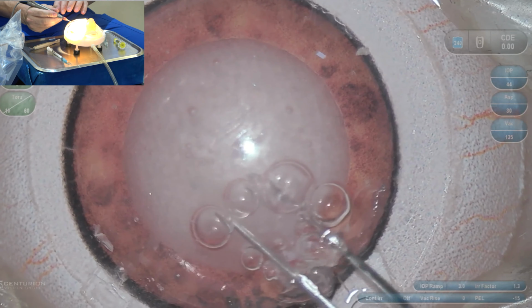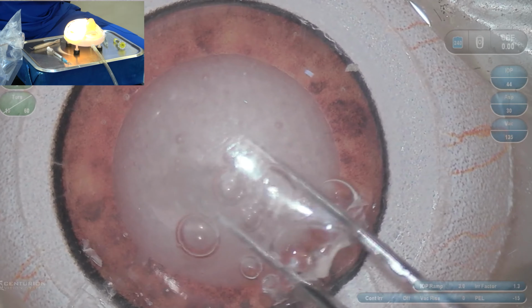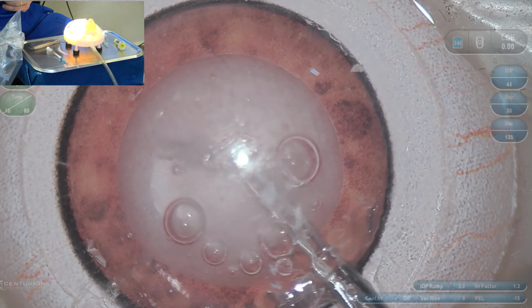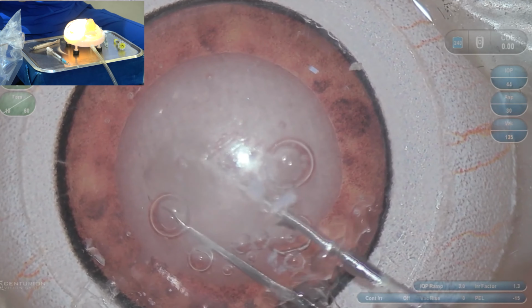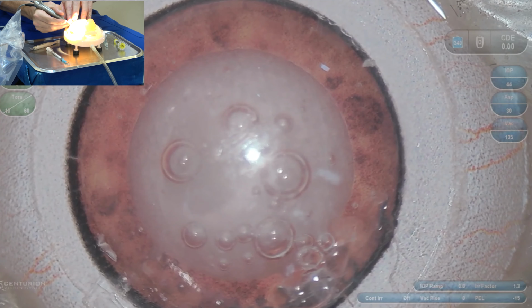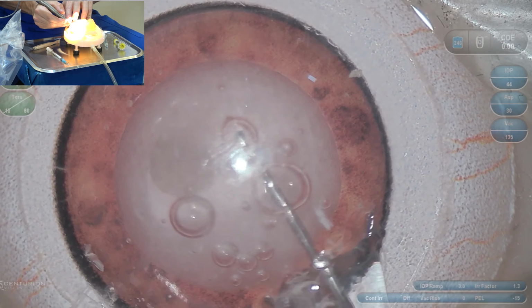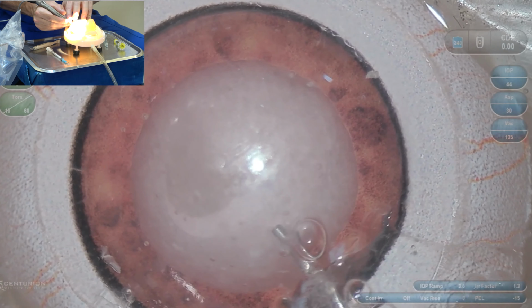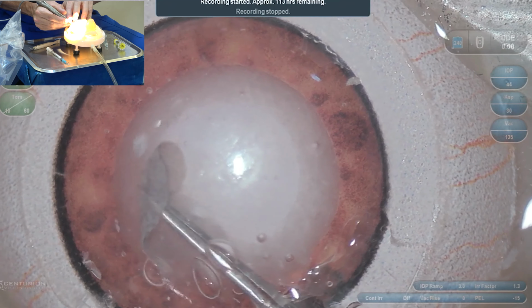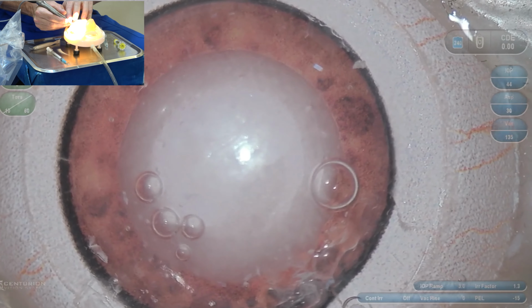Perfect. So let's start. Again, as we said before, ultrasound is going to be the king, and in this case, because it's simulated, we know it's very hard, and we're going to raise our normal parameters. Remember that there is a perfect technique to do it. You need to advance in position 3, and come back in position 1. You can also come in position 2. But it's very important for you to understand the anatomy of that trench.